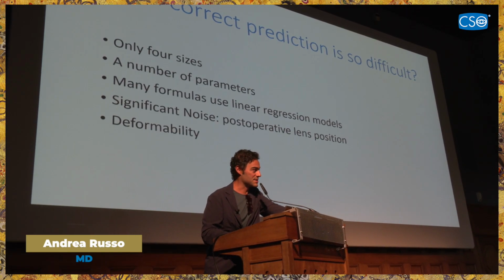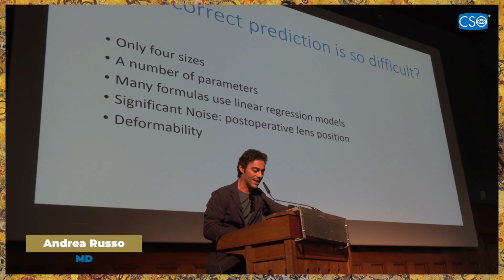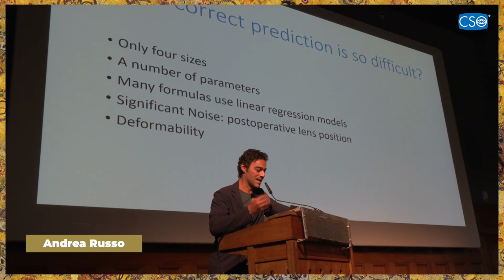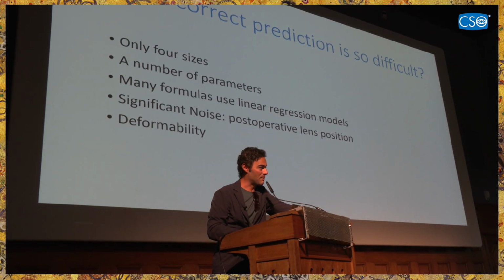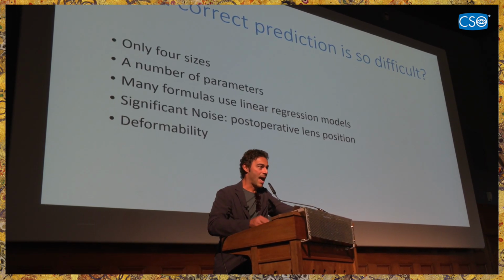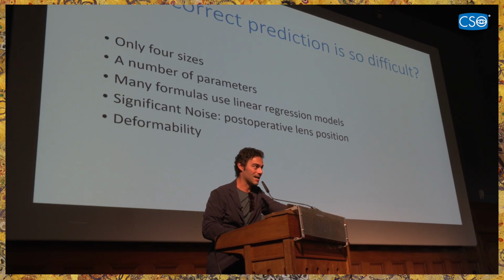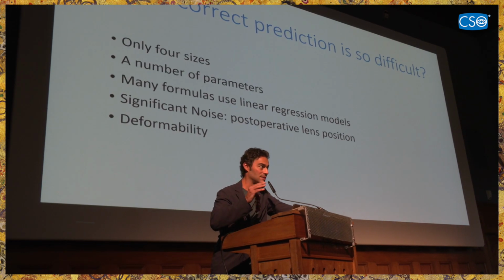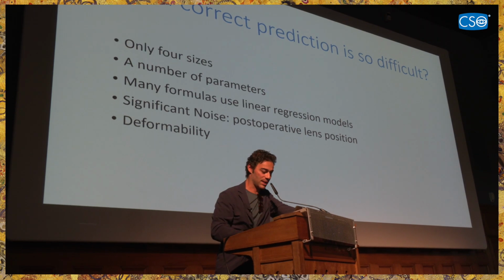Because we have only 4 sizes. I don't believe this is the answer. They are probably providing us with a new size, but still, if we have doubt with 4 sizes, having more is not easy. Of course, there are a number of parameters coming into play, and the MS-39, I will show you, is a great player in this because it objectively gives us a lot of numbers, and the more numbers, the more features, the more parameters we take into consideration, the more precise we can be.